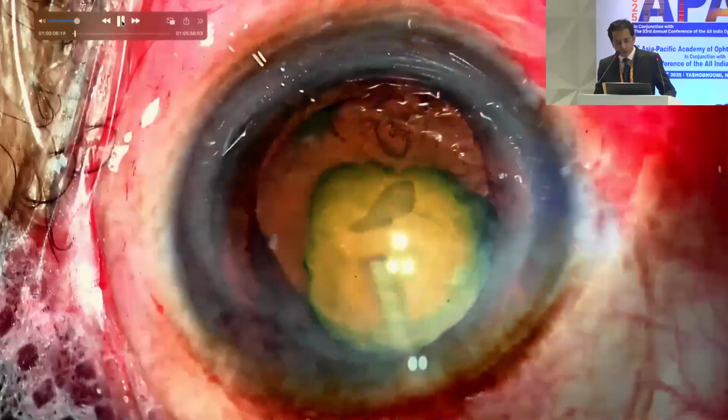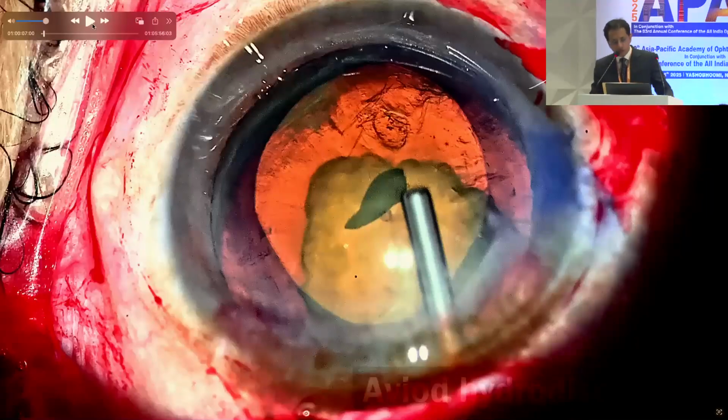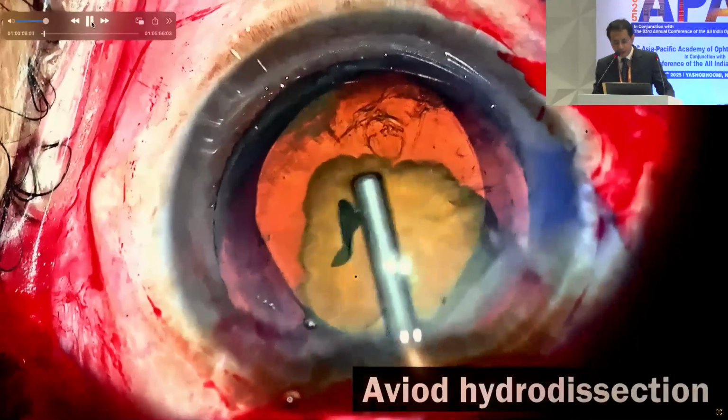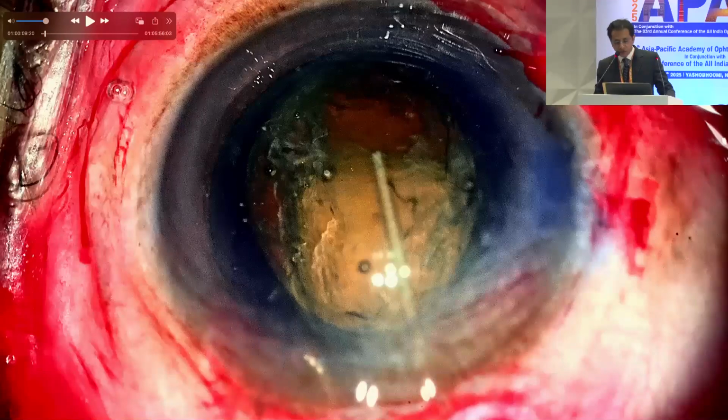Now this is a posterior polar cataract. In these situations, as we all know, there is a higher risk of having a posterior capsular tear, and of course we are avoiding hydrodissection. One change which I have made here is an oval rhexis, which is longer in the longitudinal area and shorter from the side.